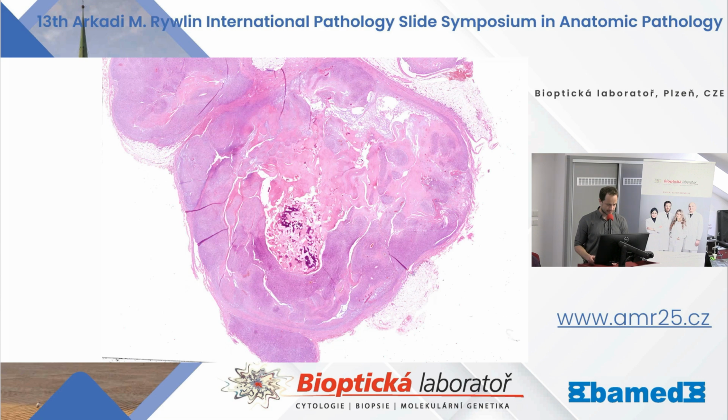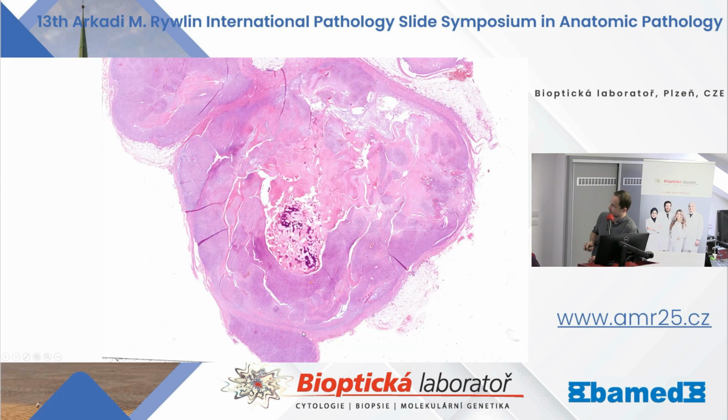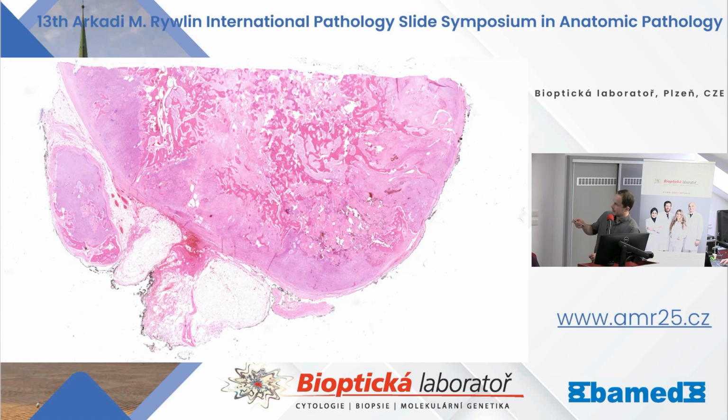Let's go to histology. I guess already on low power you can see that the calcified matrix was histologically bone. Also here on low power you can appreciate the very thick fibrous pseudocapsule, and I'm sure the soft tissue pathologists in the room already know what this is. Also notice the multinodularity of the tumor, which is quite a characteristic feature. Actually, this case is a pretty good example of this entity. Again, multinodular tumor with very prominent bone production.